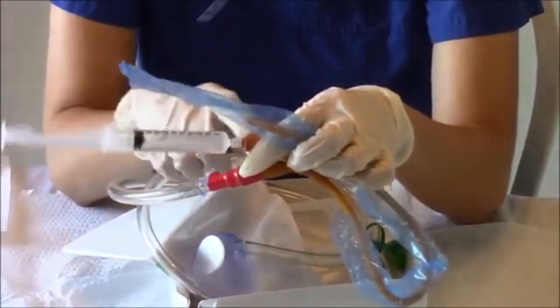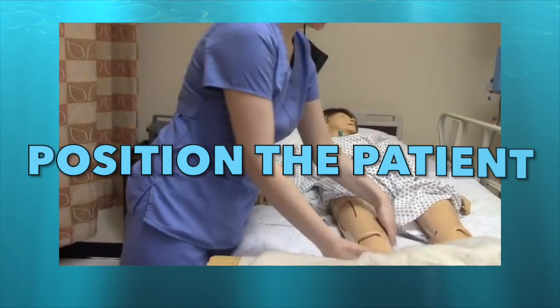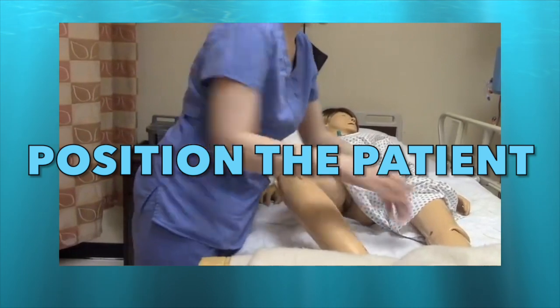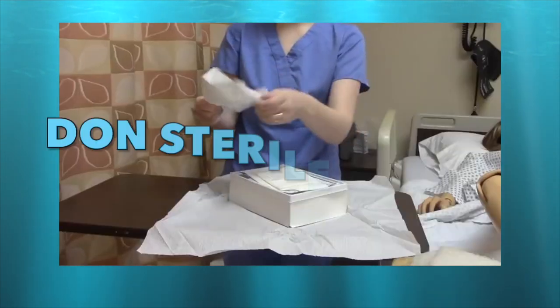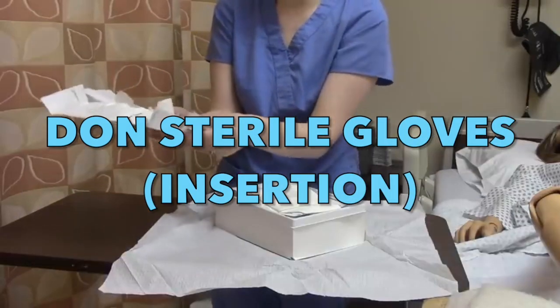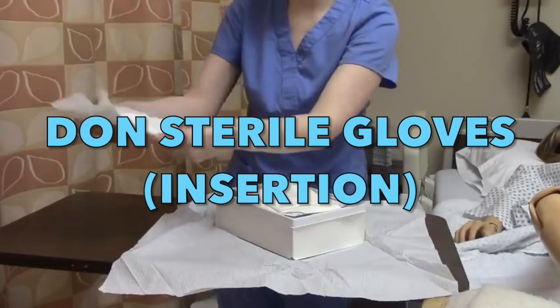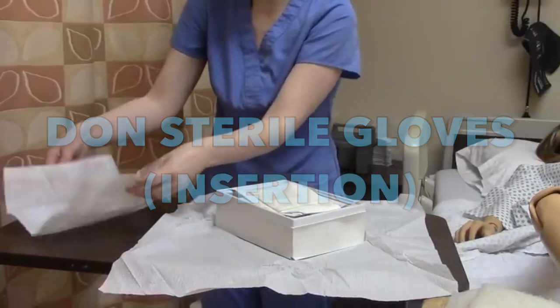We are set. Now, position your patient. Don your sterile gloves, and we are already ready for the foley catheter insertion. Always remember to maintain sterility.